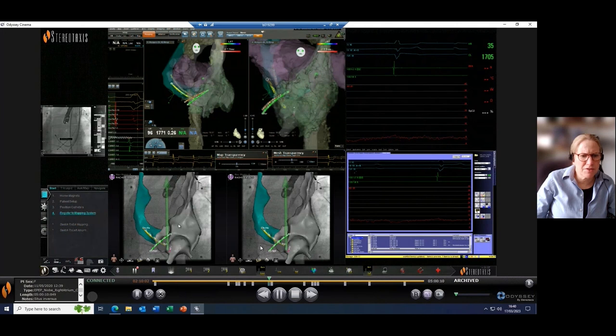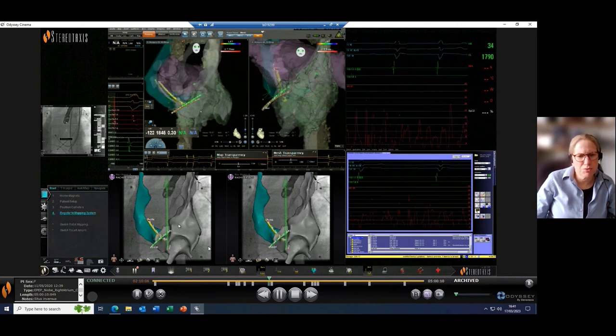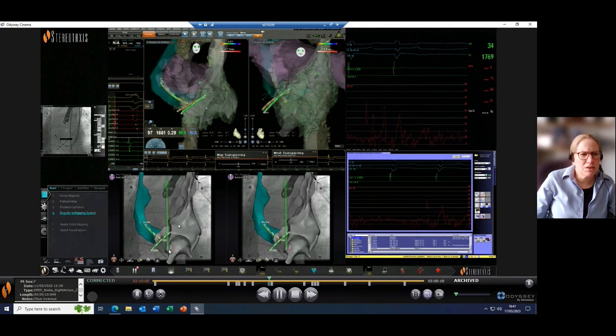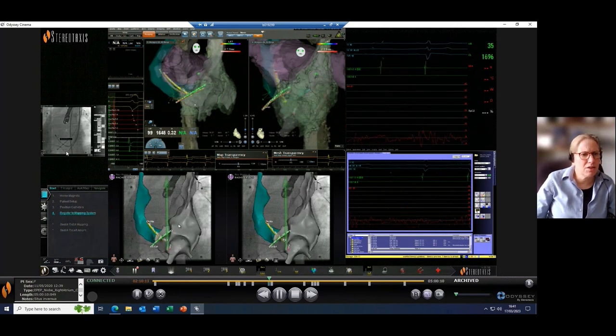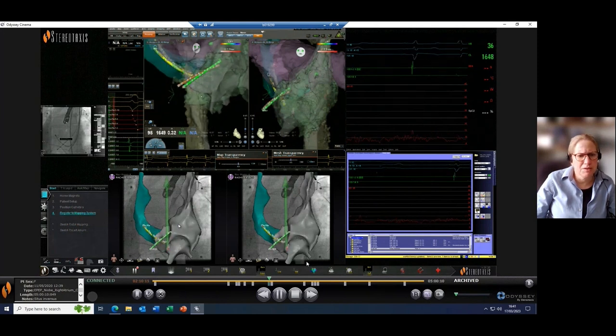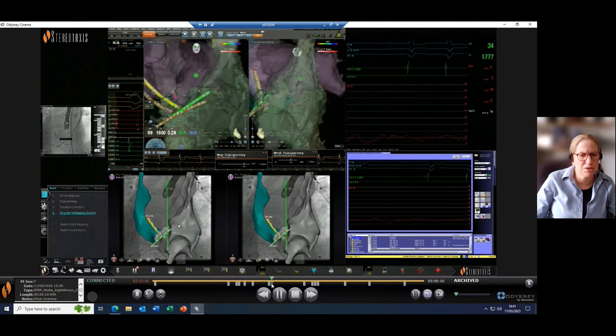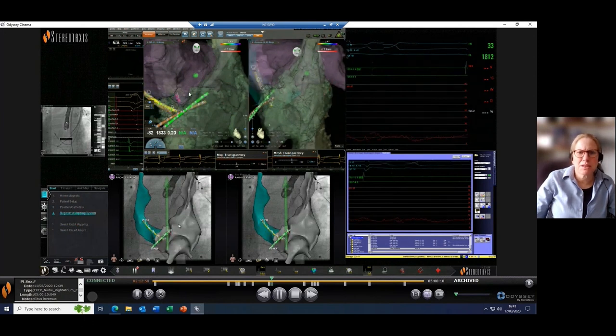Here is the RF needle tip visualization. It's a bit hard to see because we fake it as a little catheter. You see it here, there's a little 1-2 on the bottom two screens, and that shows where the needle tip is on X-ray. You see X-ray here as a small call out, and that should be relatively easy. Eventually, it will be moved to a better position. Of course, this is confirmed with TOE. You see this is already a bit better, but you see the problem, the septum points away. So it's kind of a difficult thing to achieve.